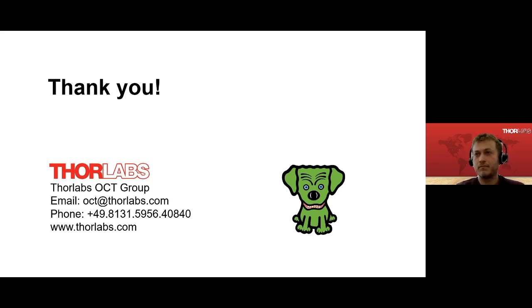Yes, so I think I'm going to answer that question. The imaging depth that we list for our lasers on our website is really just assuming that you use our provided K-clock trigger signal and a certain data acquisition card. If you do not use our K-clock signal, you could, for example, just generate your own K-clock trigger signal, or you could just monitor the K-clock trigger signal, which is sometimes called the dual channel approach.